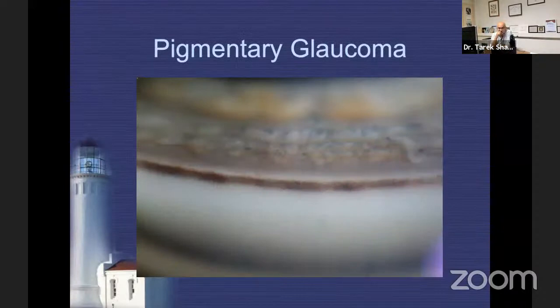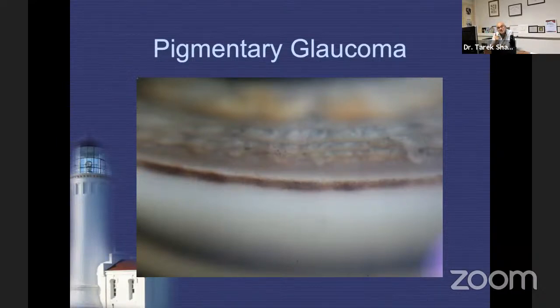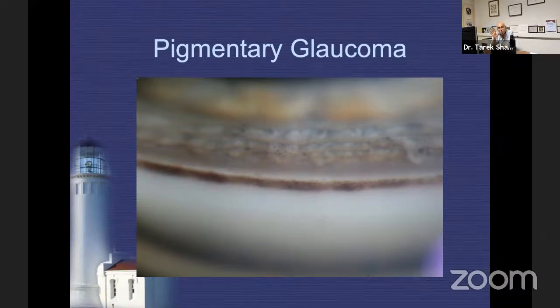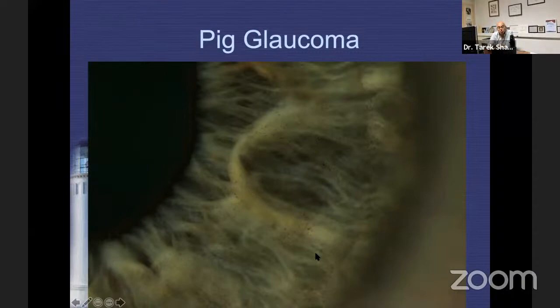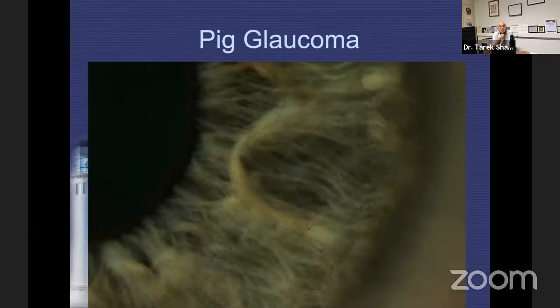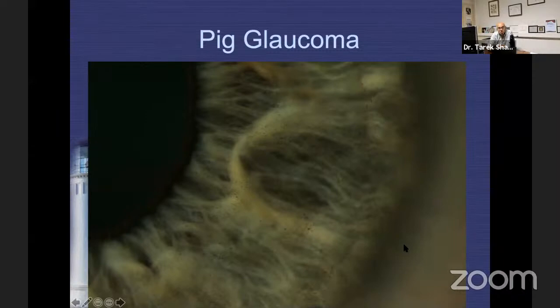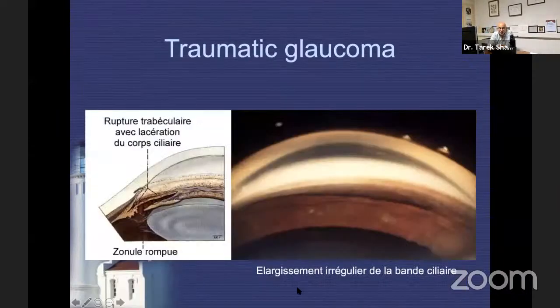Pigmentary glaucoma shows a dark band of pigmentation 360 degrees around the angle, of more or less equal darkness throughout, and without the Sampaolesi line in most cases. Even before gonioscopy you can identify pigmentary syndrome by looking at the iris — small black dots on a light iris are part of the syndrome. In advanced cases you can sometimes see corneal pigmentation at the periphery before even performing gonioscopy.